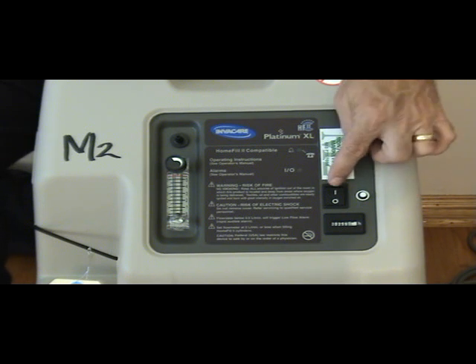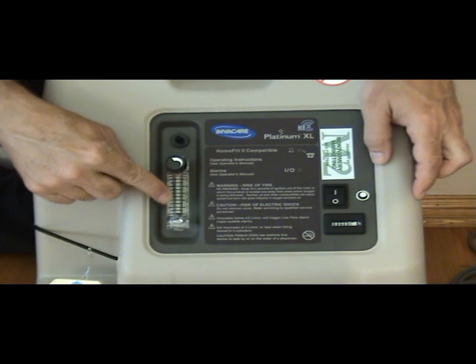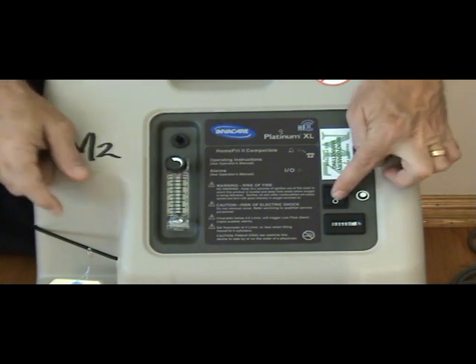So now I'm going to turn the unit on. When I turn the unit on, you will notice that the ball inside the flow meter will start to rise.